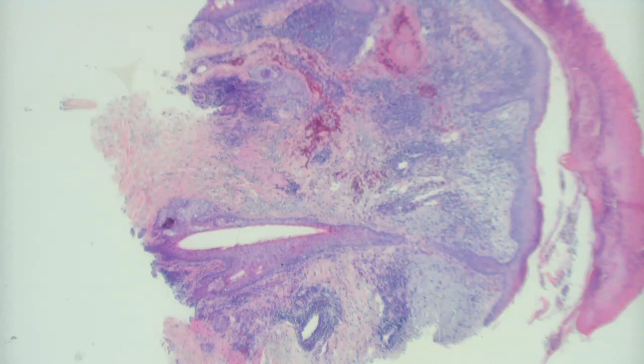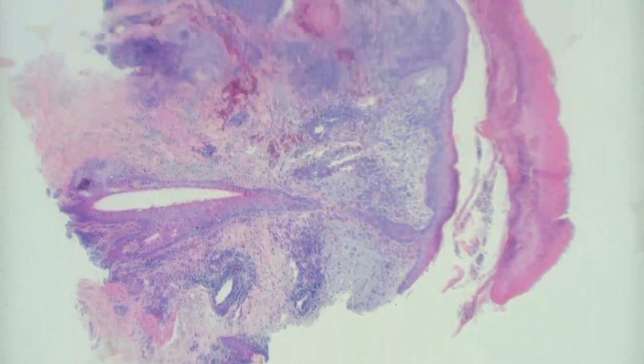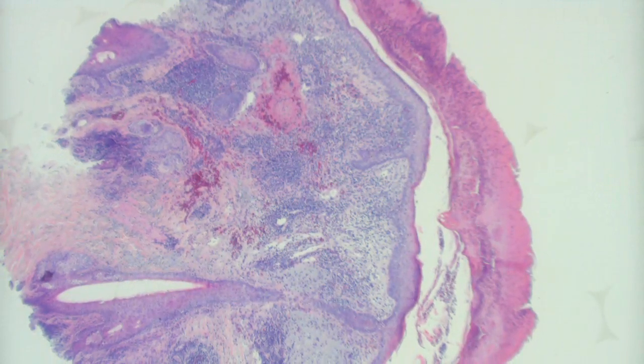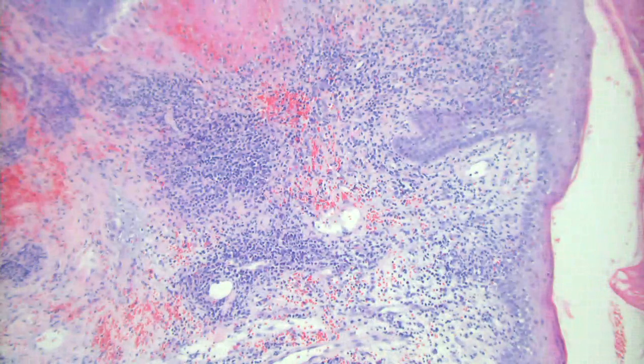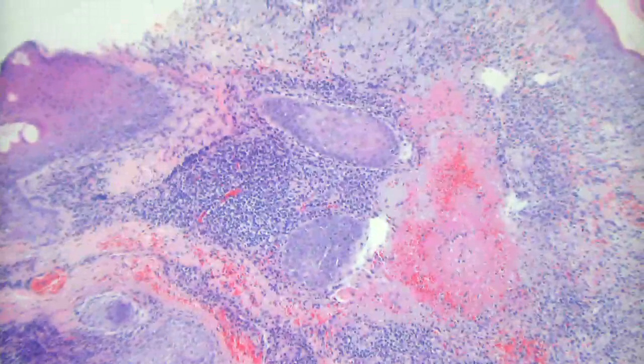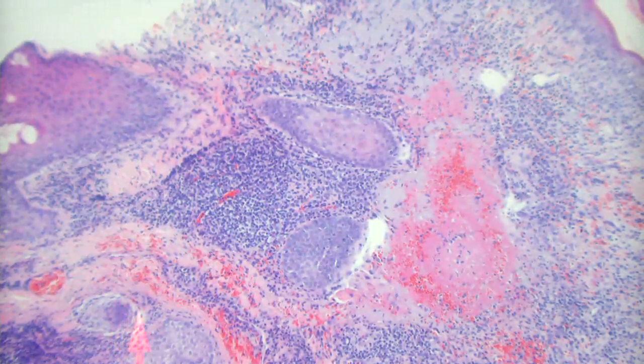Mostly lymphocytes, lots of hemorrhage, extravasated red cells tracking in and around the hair follicles and glands. It's both perifollicular and perivascular. These are large sebaceous lobules. This one has just one cut on it, but another cut may have had some demodectic mites in there also. That goes with rosacea.